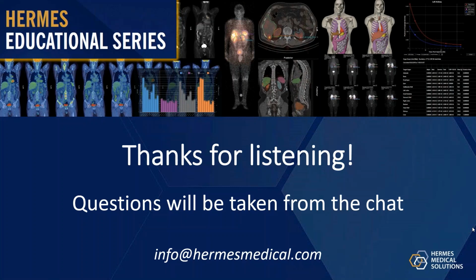But now, for example, if we have a CT that is broken in our gamma camera, and the NM doctors have to take a look at the normal planar whole body bone scans, they say that there is not enough information to make a report, because the CT and the SPECT will give you so much information, and the SUVs are so good in scaling the images in the same way, and also in the pre and post imaging, where you can compare the voxel values and the uptakes in lesion suspicious areas and so on.